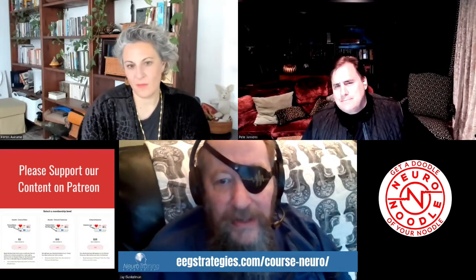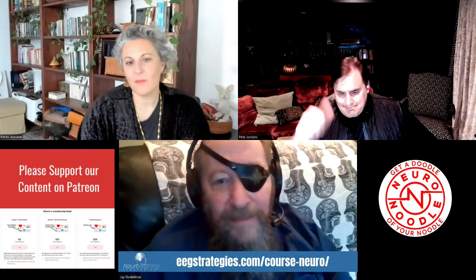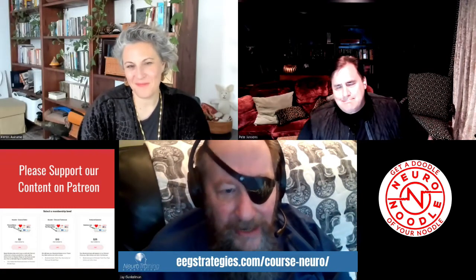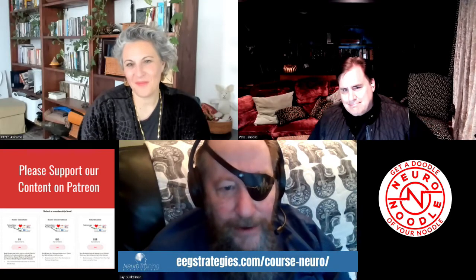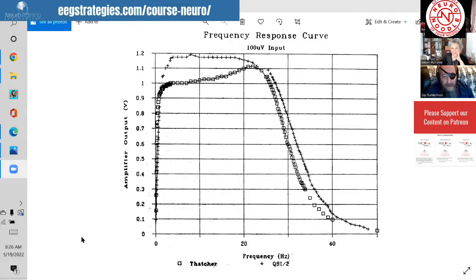The amplifiers now are really quite extraordinary by comparison to what they were. I can actually show the frequency response curves, which sounds awfully techno-geeky, but it's actually how you judge an amplifier. In the original old days, and I'm older than some of the old days in this field. Let me do a screen share here.